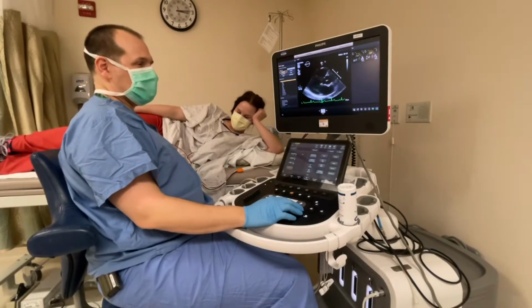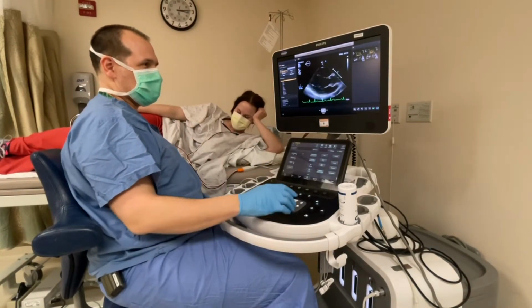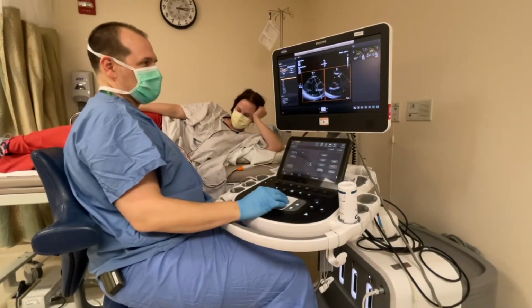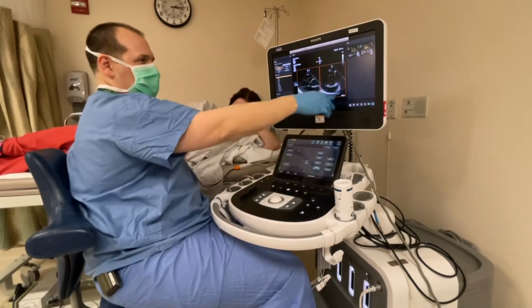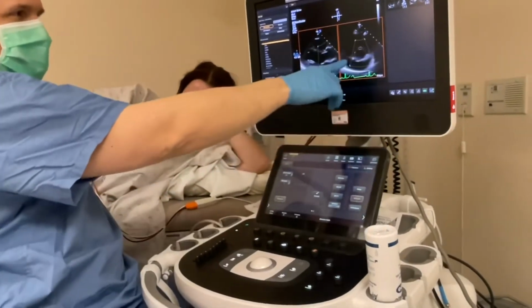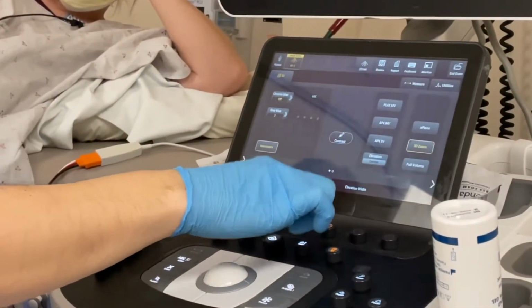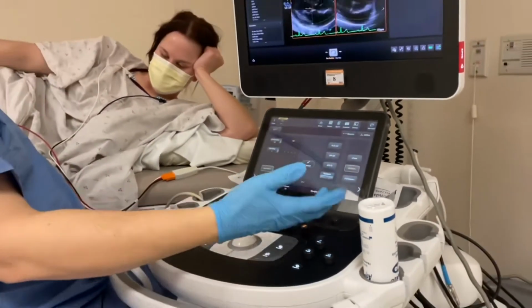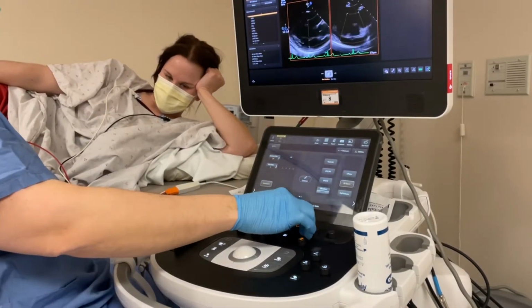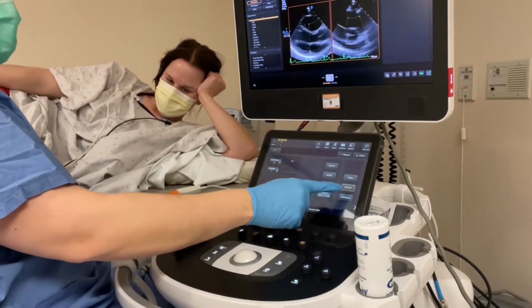All right. So next up is 3D zoom. We just get our picture here, and we'll do it on our aortic valve. 3D zoom, just like I explained, you have two different planes. If your structure isn't fitting inside your box, so our aorta is not quite fitting in there, we have our elevation width. We can turn it clockwise to make it wider, but as you make it wider, it slows the frame rate, so you can also drop it back down. And once you've got it properly situated, you can hit 3D zoom again.